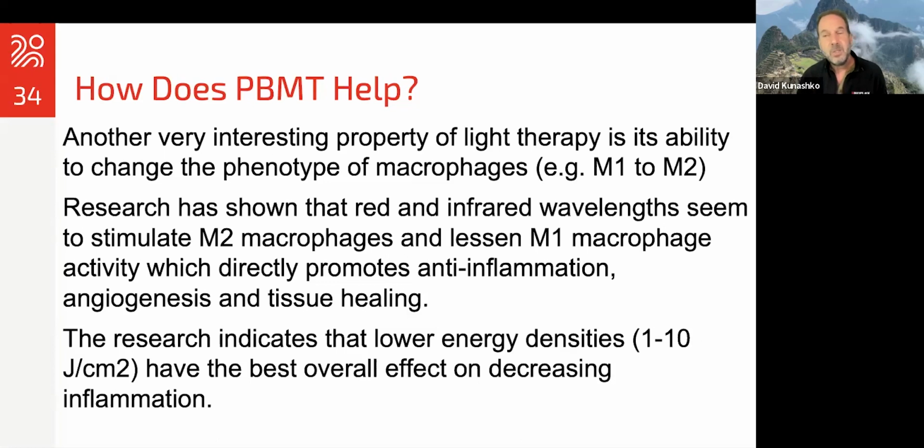They don't look at the research. It's really important to understand that photobiomodulation usually works best at relatively low energy. That's why it used to be called low level laser therapy, although it wasn't a great description, like what's low. But we know from this research that these lower energy densities are actually more beneficial.